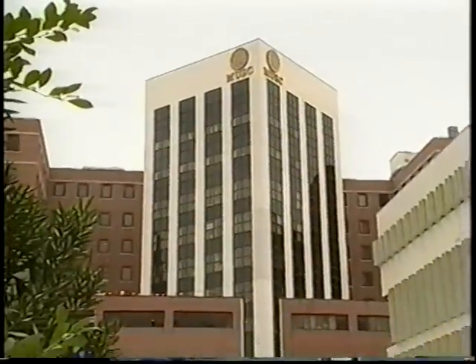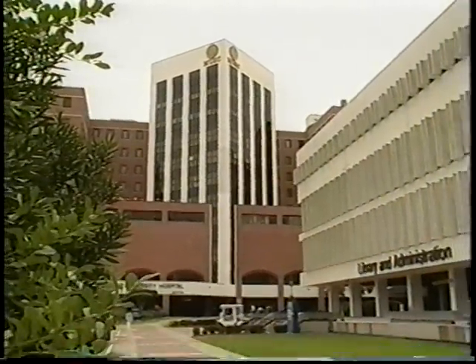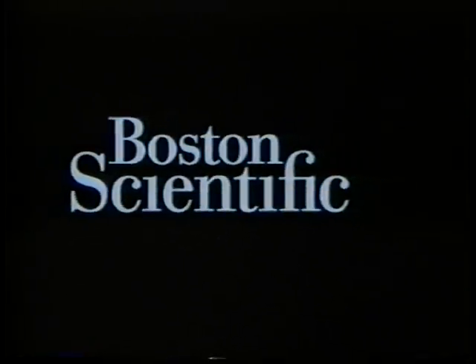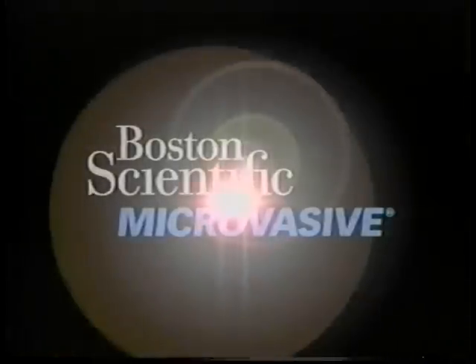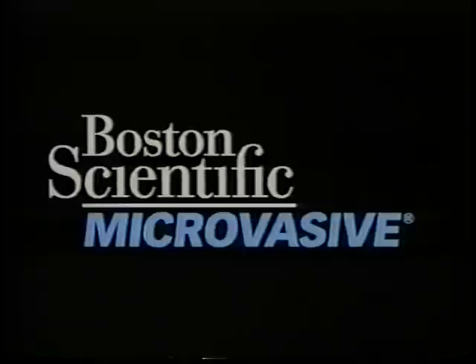The care of the patient with a PEG tube at Medical University of South Carolina provides an example of how endoscopic care can vastly improve the quality of life for the patient. We hope that this program has provided you with an in-depth understanding of percutaneous endoscopic gastrostomy, from history of development, through placement techniques, to care of the patient with a PEG.